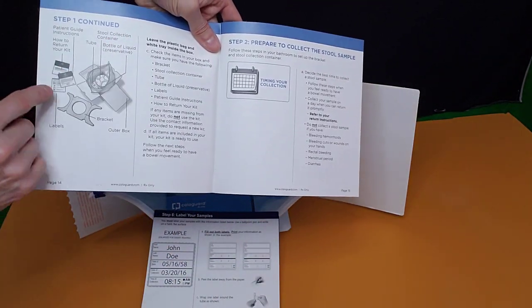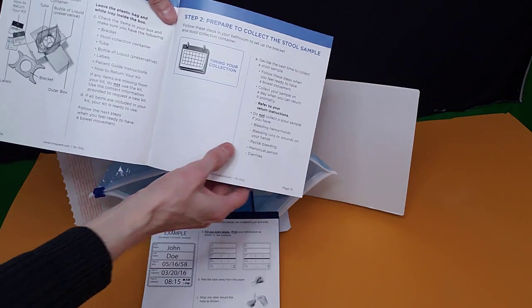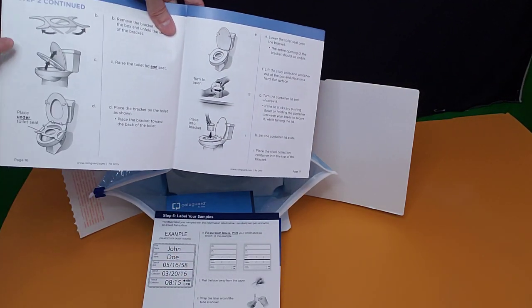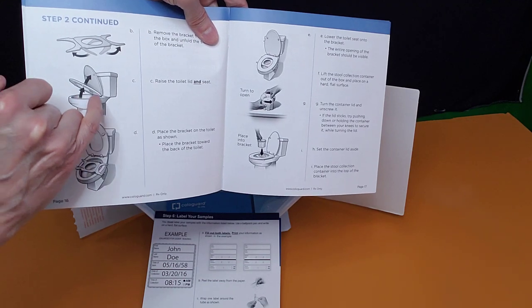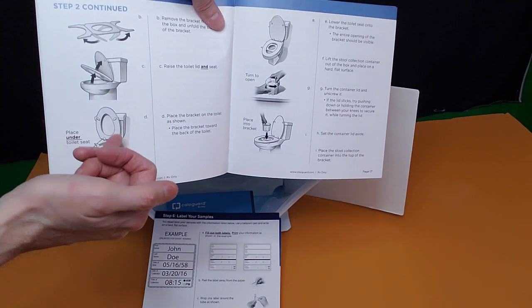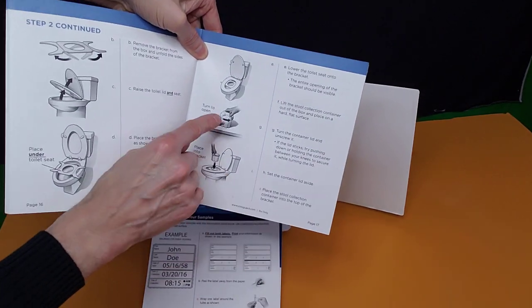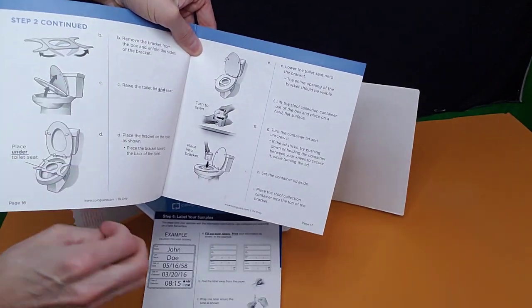Step one: you're going to look at the patient guide instructions and all the items. Step two: prepare and collect the stool sample. It shows you how to take the bracket, open it up, and put it under the toilet seat — that's the toilet lid, that's the toilet seat. You put it under the toilet seat and then shut the toilet lid down on it. Then it talks about how you're going to open up the container and put it down in the bracket so you will have your stool sample in there.